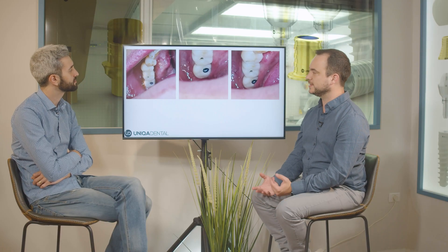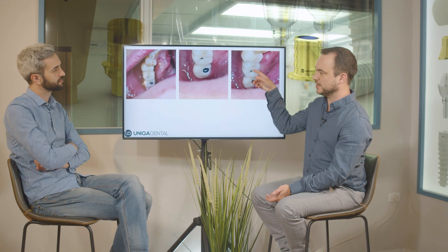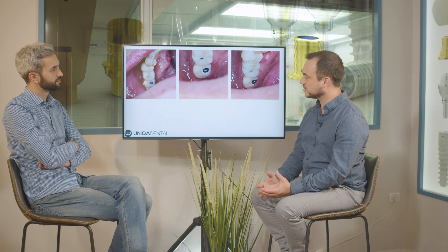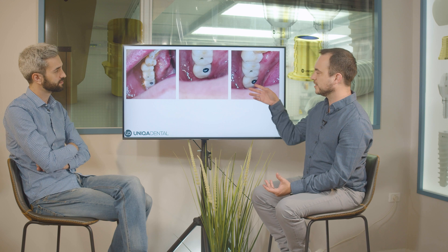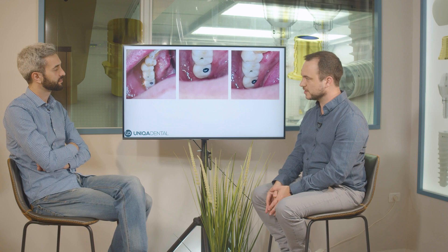Here you can see in the mouth the difference — how it looks when using a small screw channel versus a large screw channel. You can see how small the screw channel is here and how little of the tooth surface it occupies, compared to the other side where the screw channel occupies much more of the tooth surface.